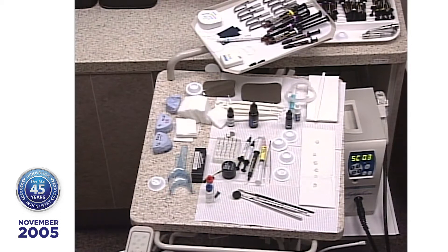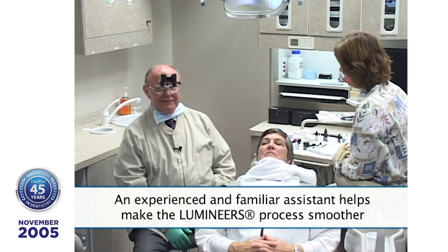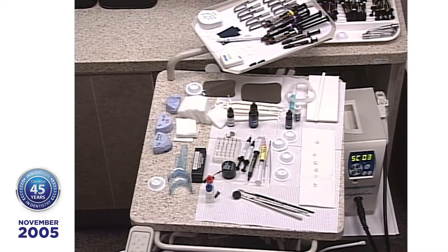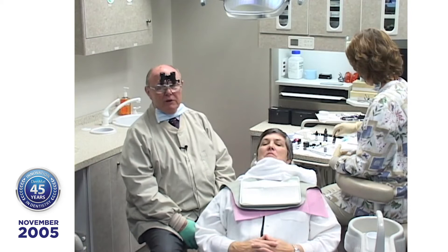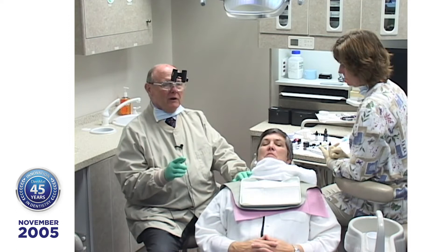Lisa has been with me for 20-some odd years. She's prepared everything, so let's take a look. She has those pieces of porcelain — because these pieces of porcelain are a matrix, and we're going to use that matrix to carry the restorative to the patient's teeth. What you really want to think about is restoring the tooth and achieving a stress-resistant, non-microleaking aesthetic restoration. That's what we're about.